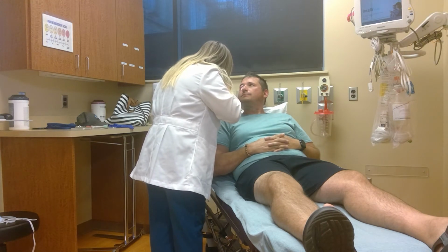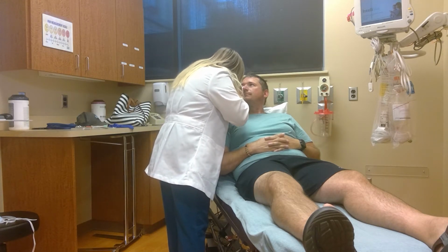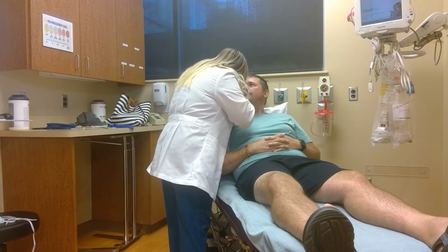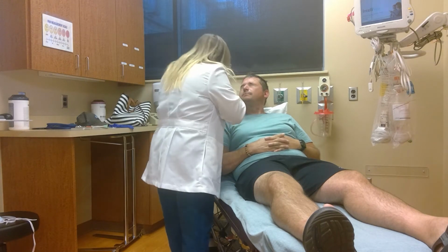I'm gonna note the red reflex. And then I'm gonna go ahead and just kind of come in here. Good. Until I do see the optic nerve. I see vessels. I see the optic cup. Cup to disc ratio looks good. No signs of hemorrhage. All right, great.